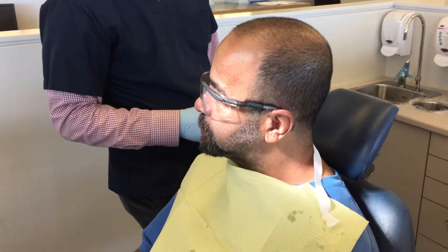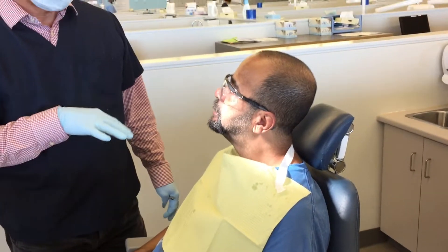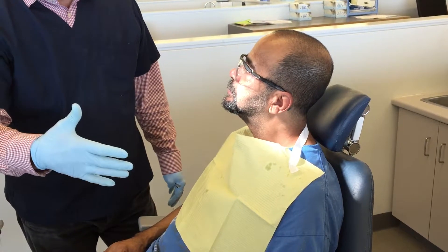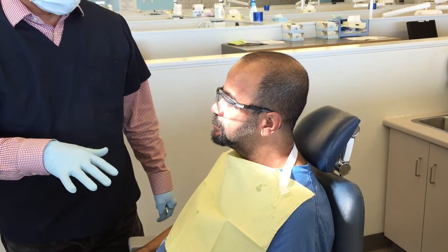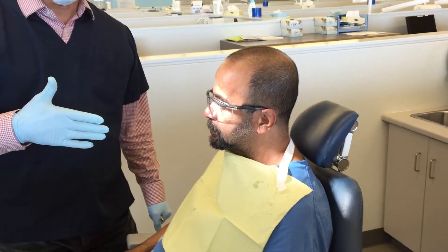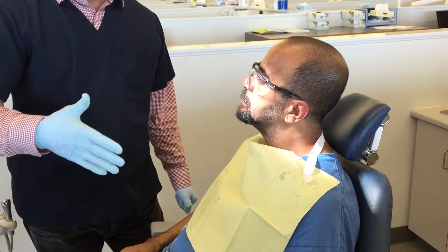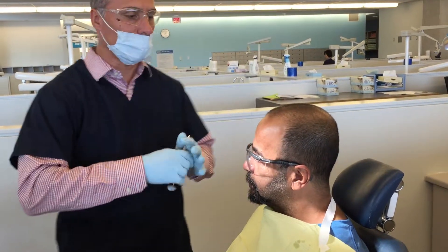Definitely a whole lot better than what you used to have, right? How's the extension in the back of your mouth? Because you mentioned that was a little long. We can always cut long things — just making them longer, that's impossible. So let's see how we manage through today, and if that's the case for the final product, we can always cut it back. We'll talk about how we prepare the posterior palatal seal in order to accommodate the patient's request.